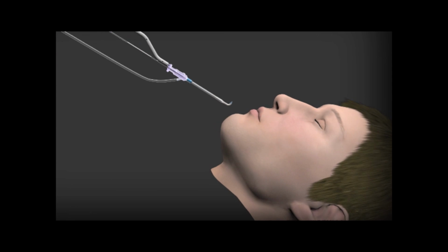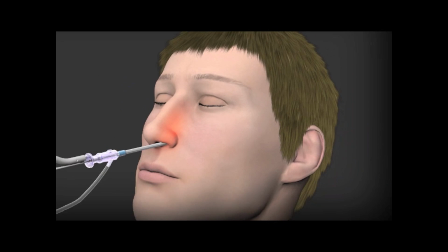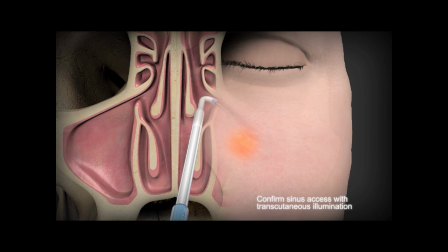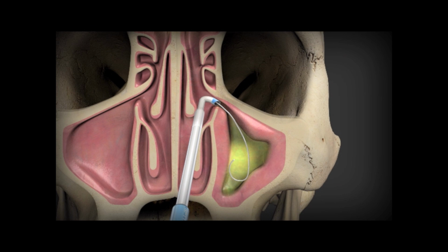We look in with a camera. We always have a little bitty scope, we call it, looking in the nose, and then we have a little introducer that you use with the other hand. We have these little introducers that are made to find those natural openings, with a gentle curve that kind of looks the right way. Get those in the right position, and then you have a little wire that's got a fiber optic cable run through it, a bright light on the end of it, and so we kind of get that to feed in.